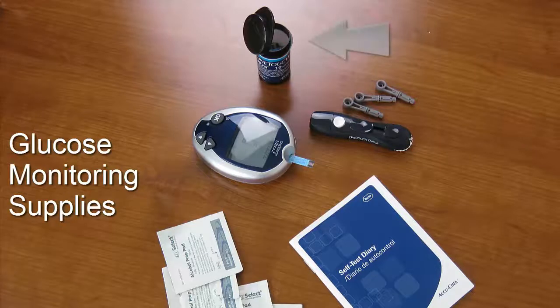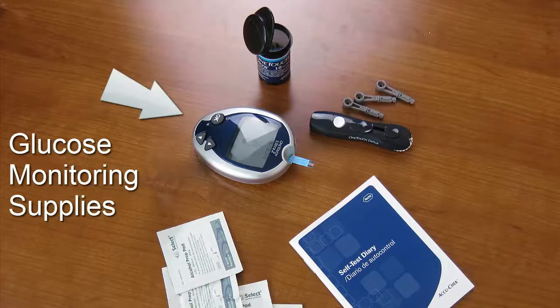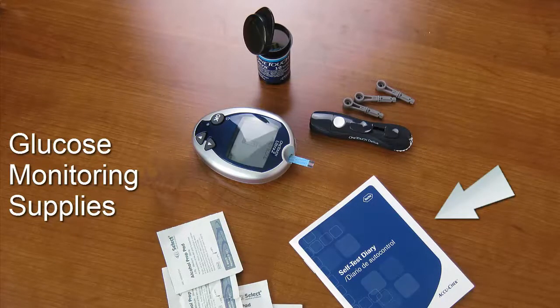The first thing to do when checking your blood sugar is make sure that you have all of your supplies set up and ready to go. As you can see here, we have our test strips, our lancing device, our lancets — otherwise known as the needles that we use to prick our finger — our glucometer, our alcohol pads, and our blood sugar monitoring diary.